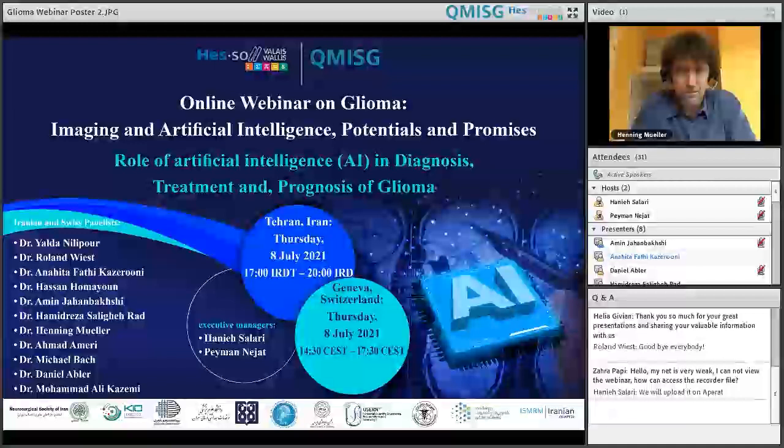As we are talking about low-grade glioma, we are especially focusing on infiltrative astrocytoma, where the problems are greater. The parts of tumoral tissue early after surgery show higher ADC values, such as 1.4, 1.5, and it is helpful.